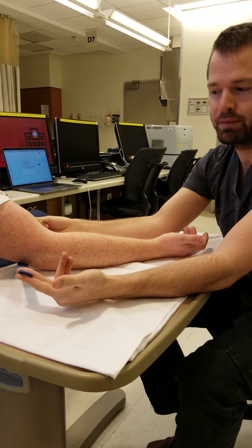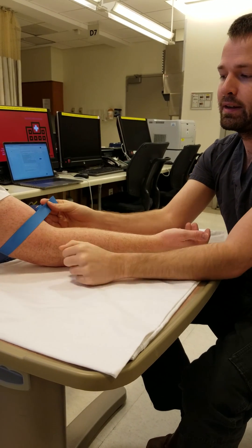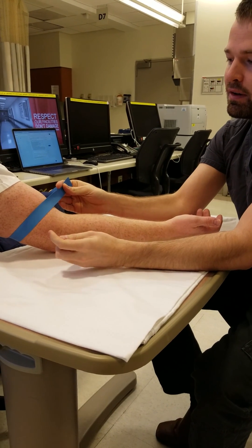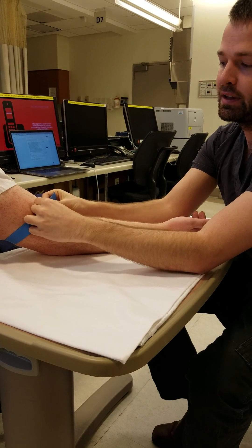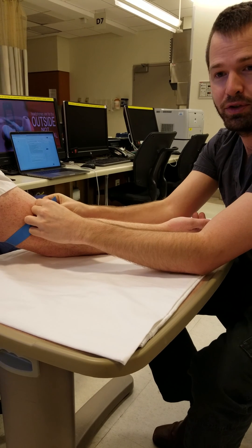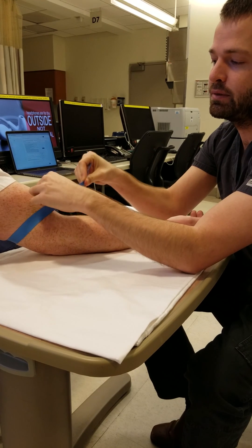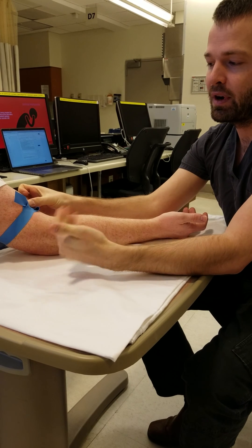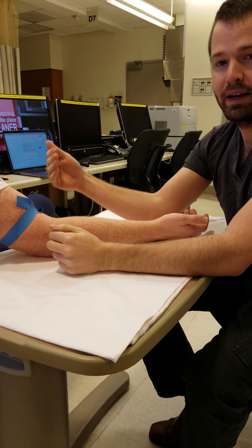The first thing I do is decide the level I'm going to place it, keep it flat, roll it around the arm, and make sure that as it travels around the circumference of the arm, there's no pinch points. Then I hold it in gentle tension, and every time I tighten it, I tighten it the same way. I pull about two inches away from the arm, and I tuck it underneath. What I've done is guarantee that the entire thing remains flat, and I'm always applying the same amount of pressure.